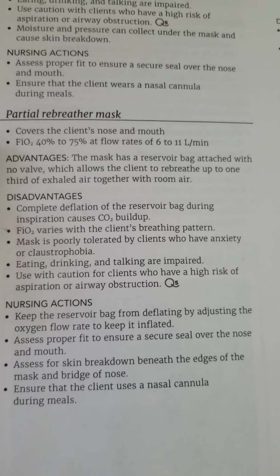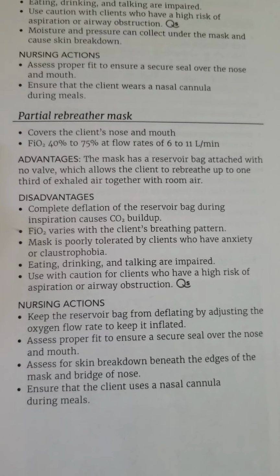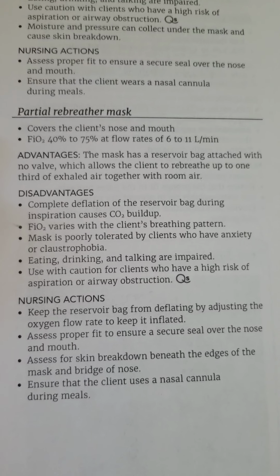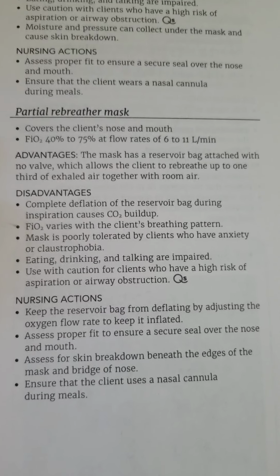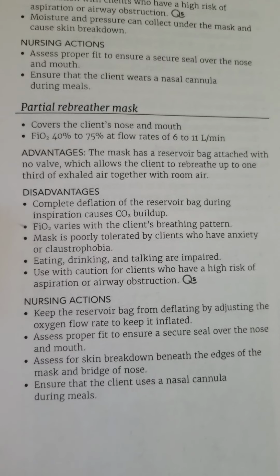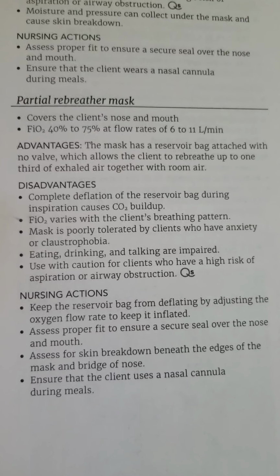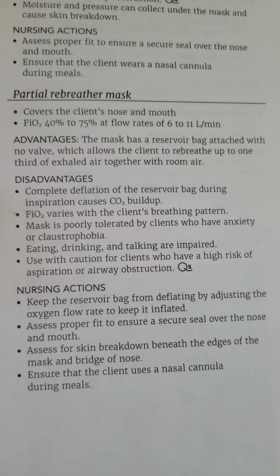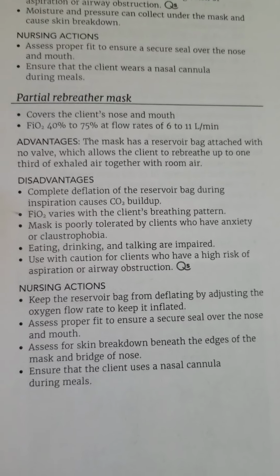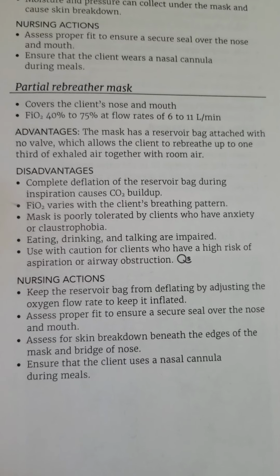Disadvantages are that the complete deflation of the reservoir bag during inspiration causes CO2 buildup. FiO2 varies with the client's breathing pattern. Mask is poorly tolerated by clients who have anxiety or claustrophobia. Eating, drinking, and talking are impaired. And we need to use with caution for clients who have a high risk of aspiration or airway obstruction.